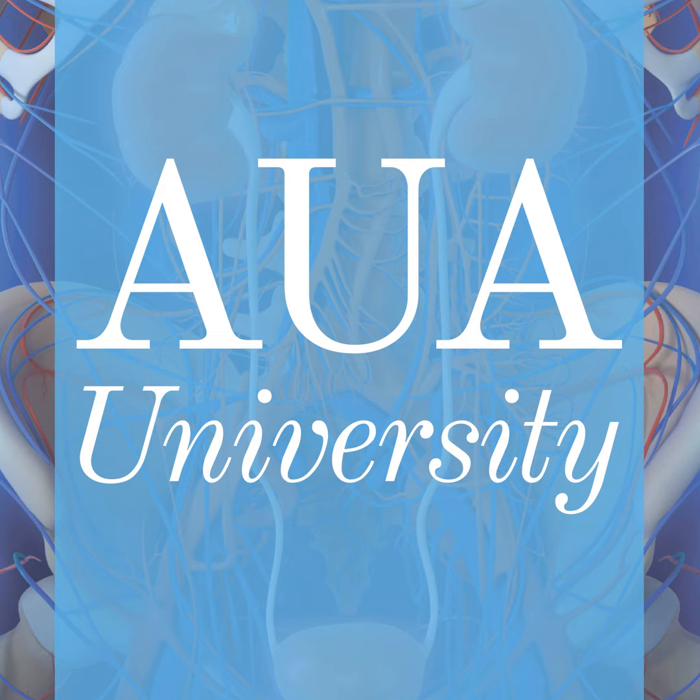And again, PSA at PET and reflecting in the value of doing the PET scan appropriately. That sweet spot, I think, is 0.5 or less, when you're going to have at least a 50% detection rate. And here, as you've also heard, Gleason score is also an independent feature related to the potential for a postoperative PSMA PET positive scan.